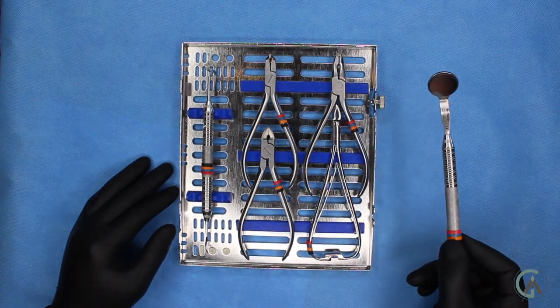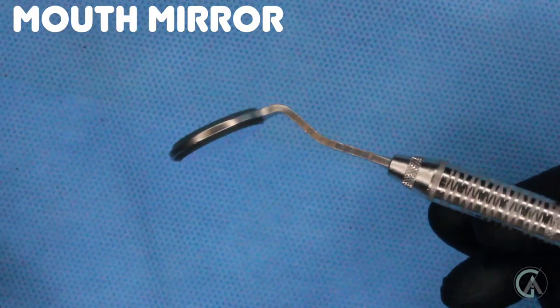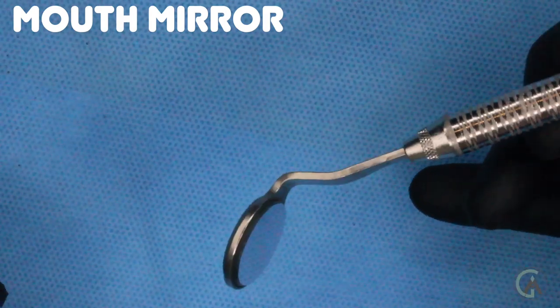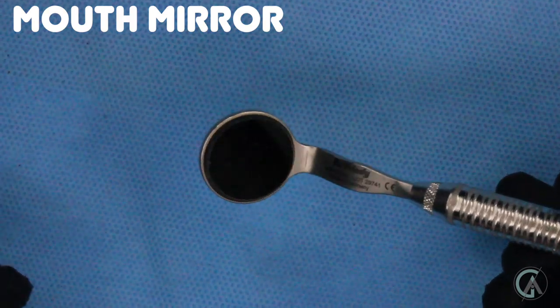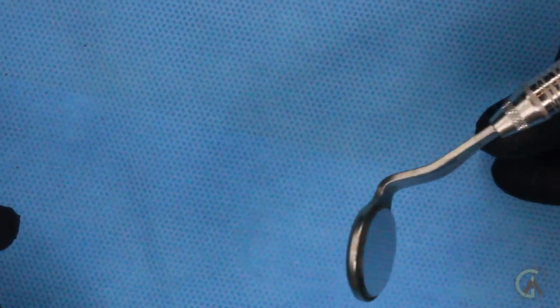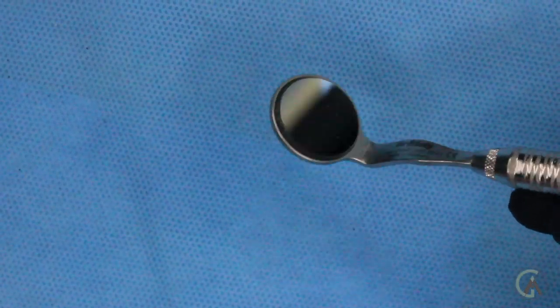First is a dental mouth mirror. A lot of you guys are familiar with this one — it does exactly what you would think, it's a mirror. I like that it has a little bend to it because then I can retract the cheeks a bit. These are made by Hugh Freedy, and it's pretty neat because on the back side there's another mirror. The idea is that you can stretch the cheek and then look in the back mirror — but to be completely honest, I never use that side.